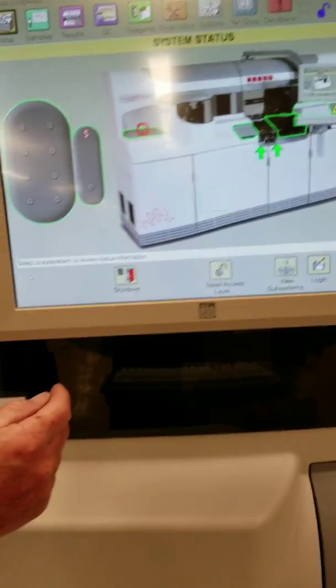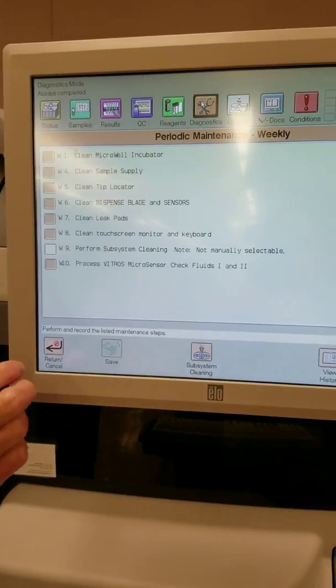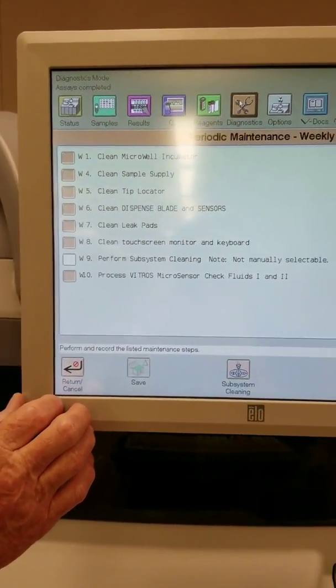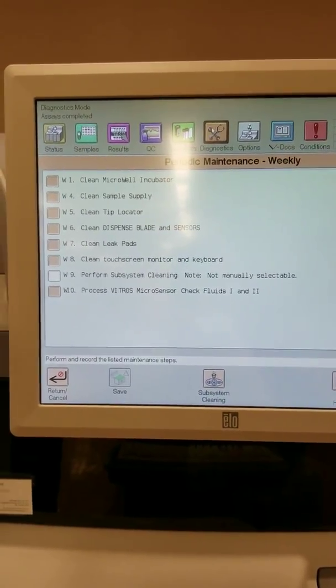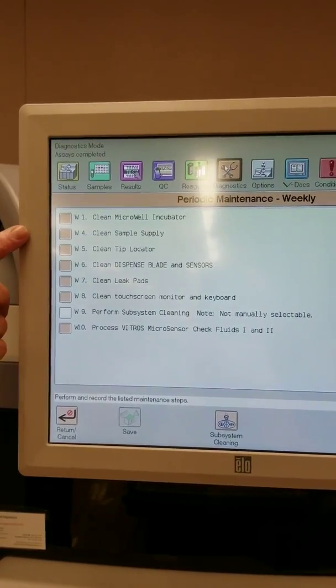To begin, we'll go to the computer system here. You go to diagnostics and it shows you a menu of your periodic maintenance weekly, and it gives you a list of all the checklists you'll have to go through. The first thing is to clean the micro-well incubator.